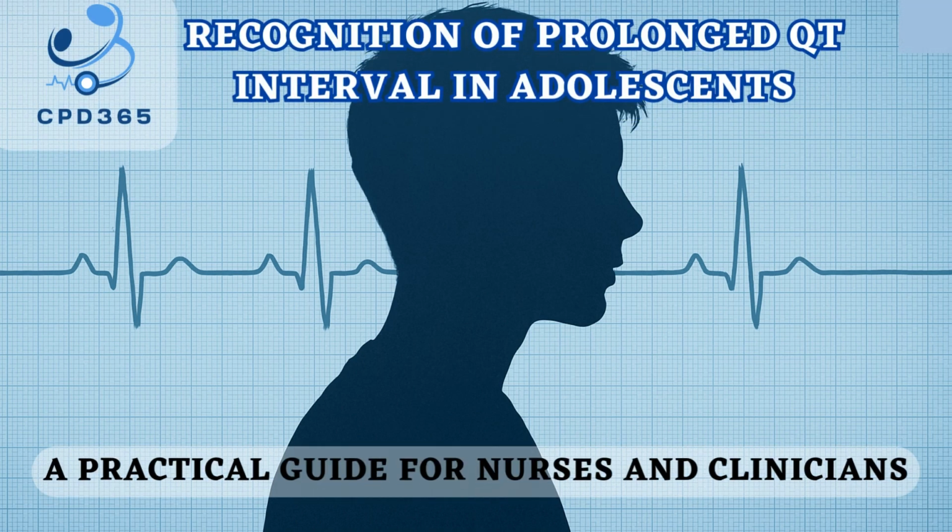Welcome to Recognition of Prolonged QT Interval in Adolescents, a practical guide for nurses and clinicians. This course has been created to enhance your confidence and accuracy in identifying prolonged QT intervals in adolescents, a critical yet often misunderstood area of pediatric and adolescent ECG interpretation.